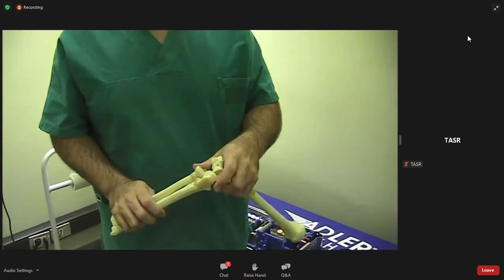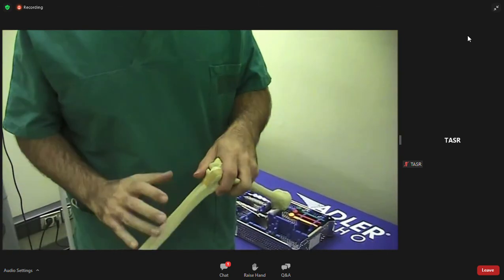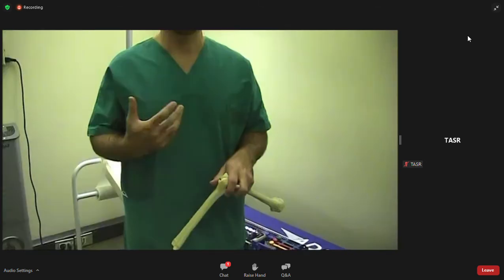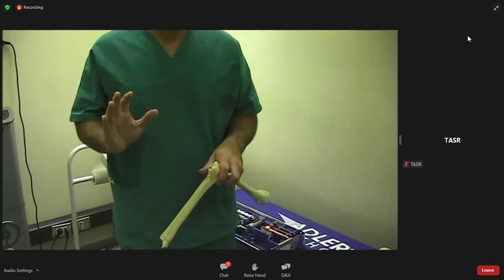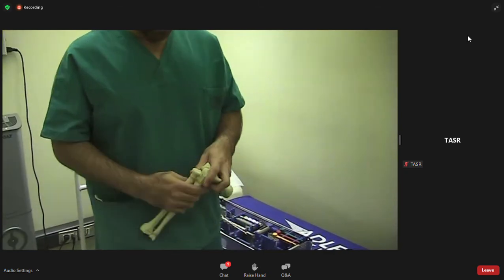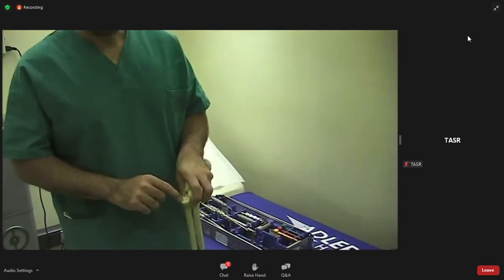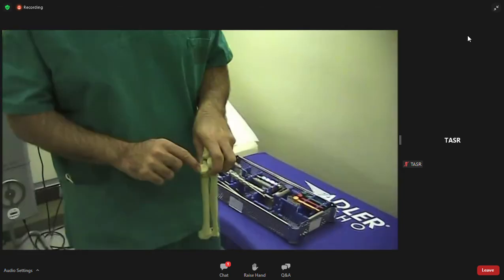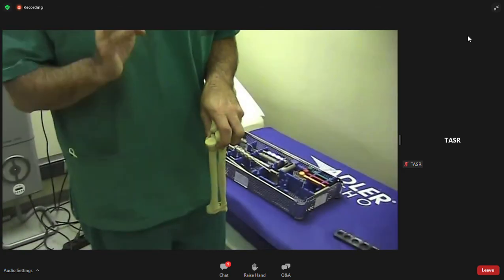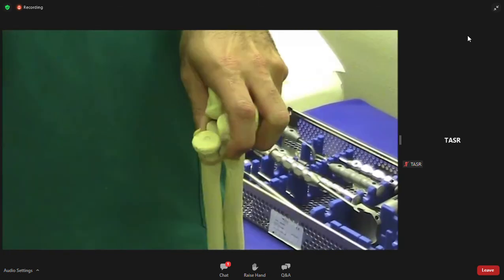This is clearly a sawbone, and I'm going to explain you a couple of concepts on how to facilitate your work into the joint A and the sizing of the joint of the prosthesis B. Let's talk about sizing for a second. Let's say that you have your radial head here, and you all know that the radial head is not a perfect circle, but it's an oval. Even more precisely, when you replace the radial head, you are technically replacing 2 joints and not just one.